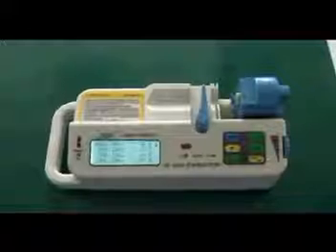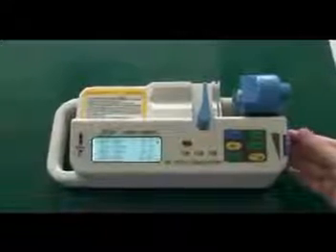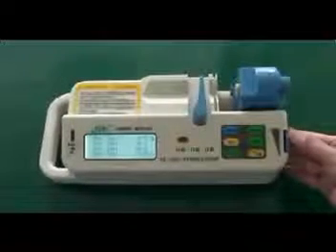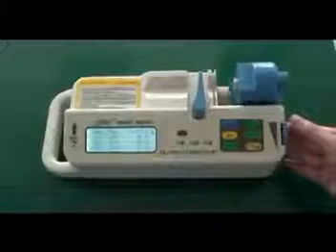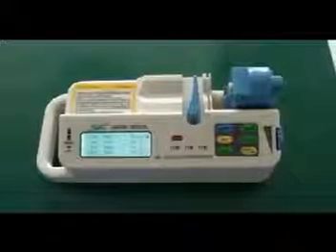Thirdly, turn the adjusting knob to make the cursor point at set 50 ml. Then, fix the 50 ml syringe into the pump.